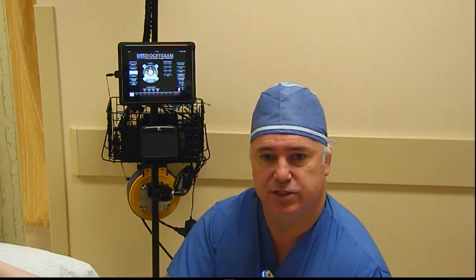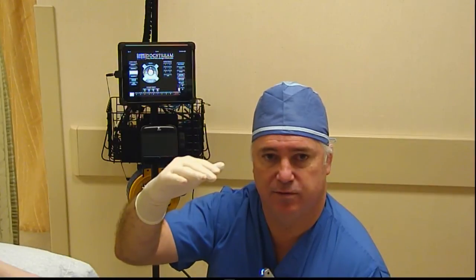If you have a patient you don't want to turn laterally for whatever reason and just want to leave them supine, you don't have to worry with movement — you can just raise the leg up on a Mayo stand with a pillow, keep their leg nice and comfortable, and do this approach. With this approach, you have to push really hard on the ultrasound probe and put a lot of pressure on it. It doesn't hurt the patient at all, but you have to maintain good contact. The other thing is your needle approach on the patient is just the opposite of what you see on the screen, because your skin is at the bottom on the inferior part of the patient, and on the ultrasound screen your skin is at the top of the image. So unless you invert that — which you can do on your ultrasound machine — you're going to have to think in inverse proportions with your needle movements. I've done this many, many times, so I've gotten used to it. It's pretty easy once you get used to it. So we're going to get her ready for her ankle scope, do her saphenous block, and get her into the operating room. Thank you.